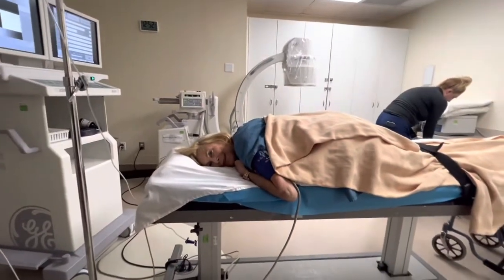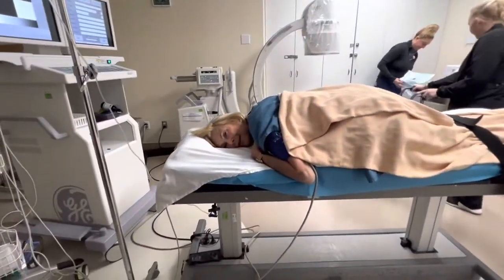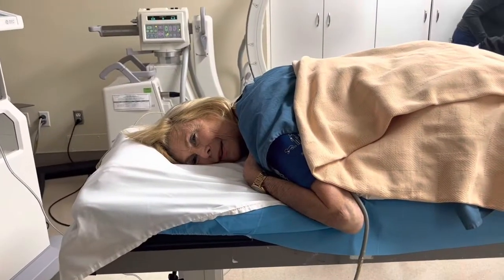Here we are in the procedure room. This is Mrs. M. We've just completed a kyphoplasty. Kyphoplasty was at L1. Mrs. M had a fracture at L1.